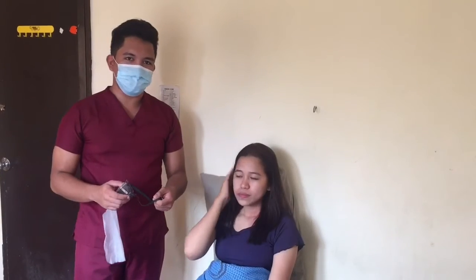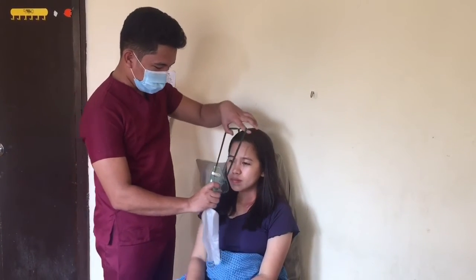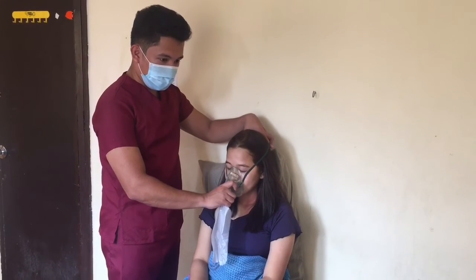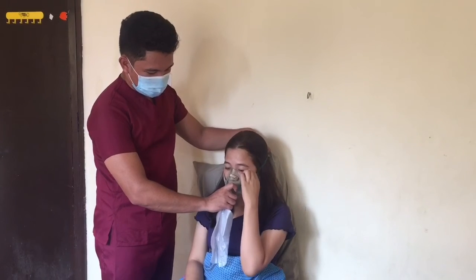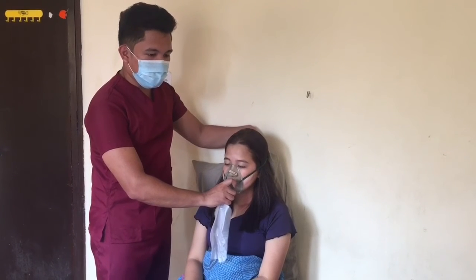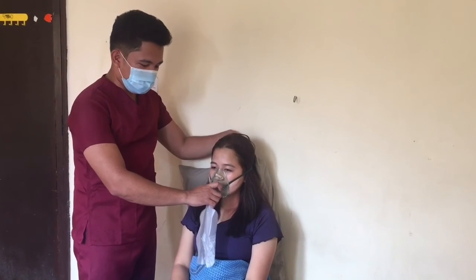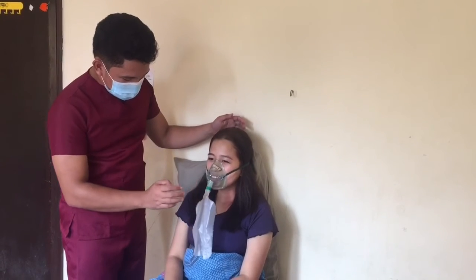So next, I'm going to administer the non-rebreather mask. Guide the mask towards the client's face and apply it from the nose downward. And fit the mask to the contours of the client's face. Secure the elastic band around the client's head so that the mask is comfortable. Okay na yung ginawa, ma'am? Yes, nurse.